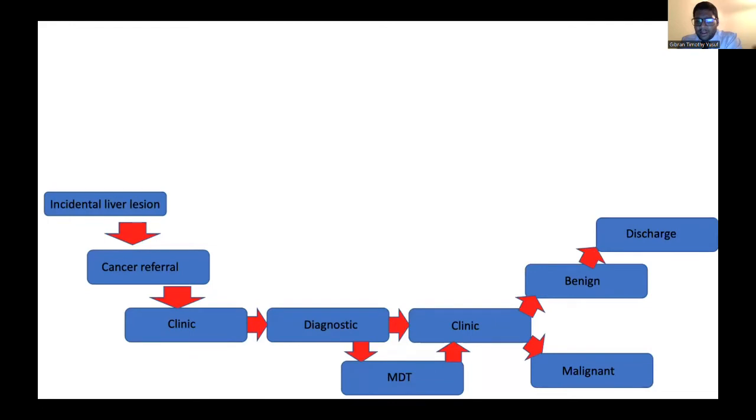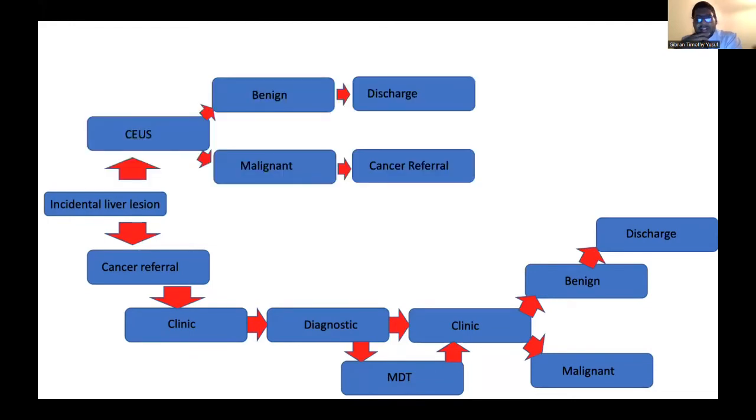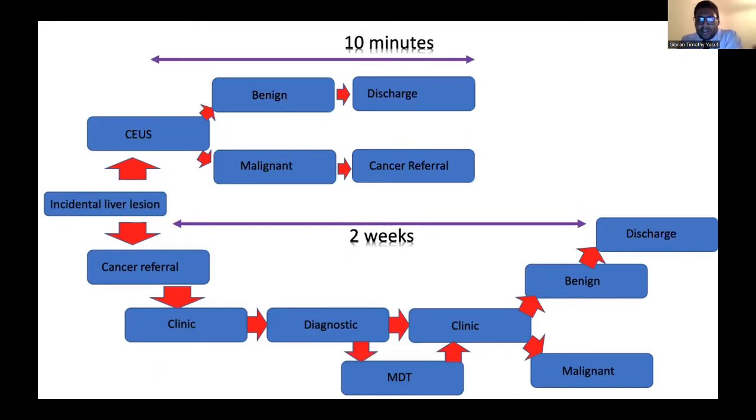If it's benign, you plan to discharge. Factor in contrast enhanced ultrasound. In the room, you are able to say benign or malignant. In the room, you are able to say this is something which can be discharged, or does need to stimulate a cancer referral. What's the length of time? 2 weeks versus 10 minutes.